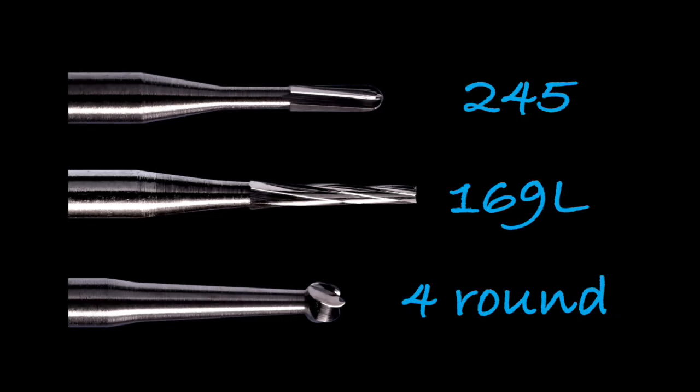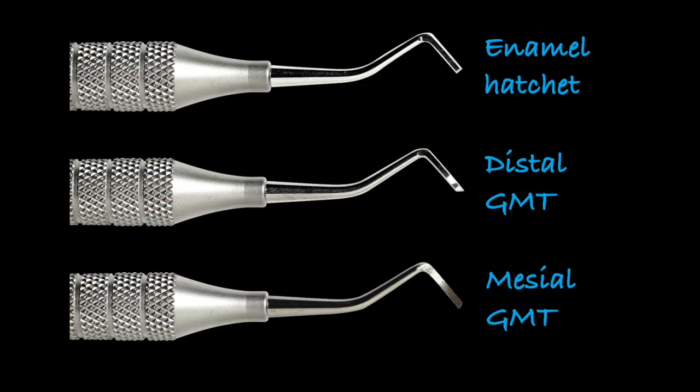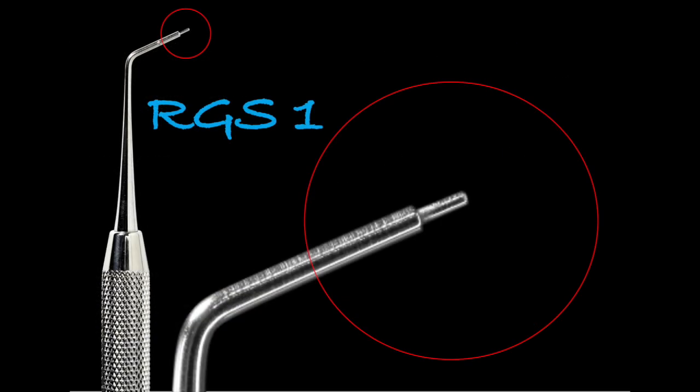We're going to need a 245, 169L, and a four round bur for the amalgam slot preparation. I'll also talk about the composite. We need the enamel hatchet, the mesial and distal marginal trimmers — and even though we're performing a distal slot, we'll also need the mesial, and you'll see why later. An RGS1 is essential so we can determine the proper amount of clearance with the adjacent tooth.